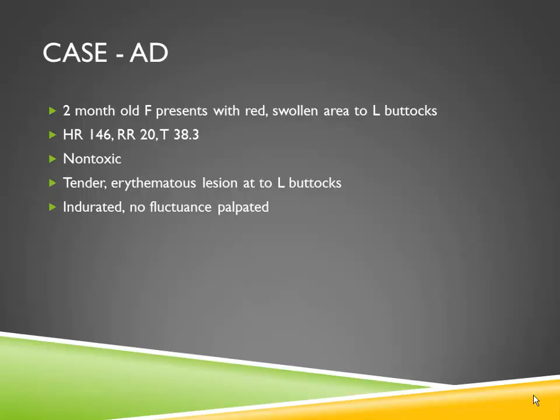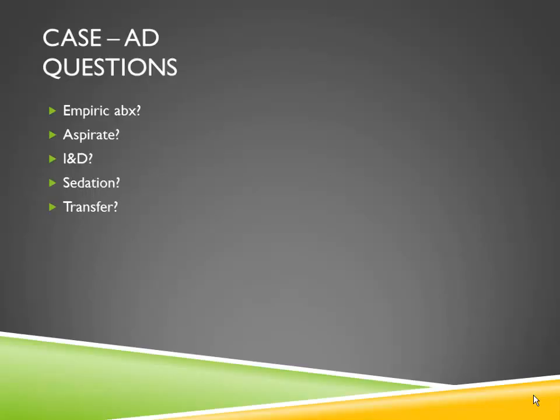She's not toxic appearing. Right on that left buttocks area, she's got a little tender red lesion. It feels indurated, but you don't really feel any fluctuance. It's not draining or anything, so you're left figuring out what you should do with this. There are a lot of different options and a lot of different things you have to think about.